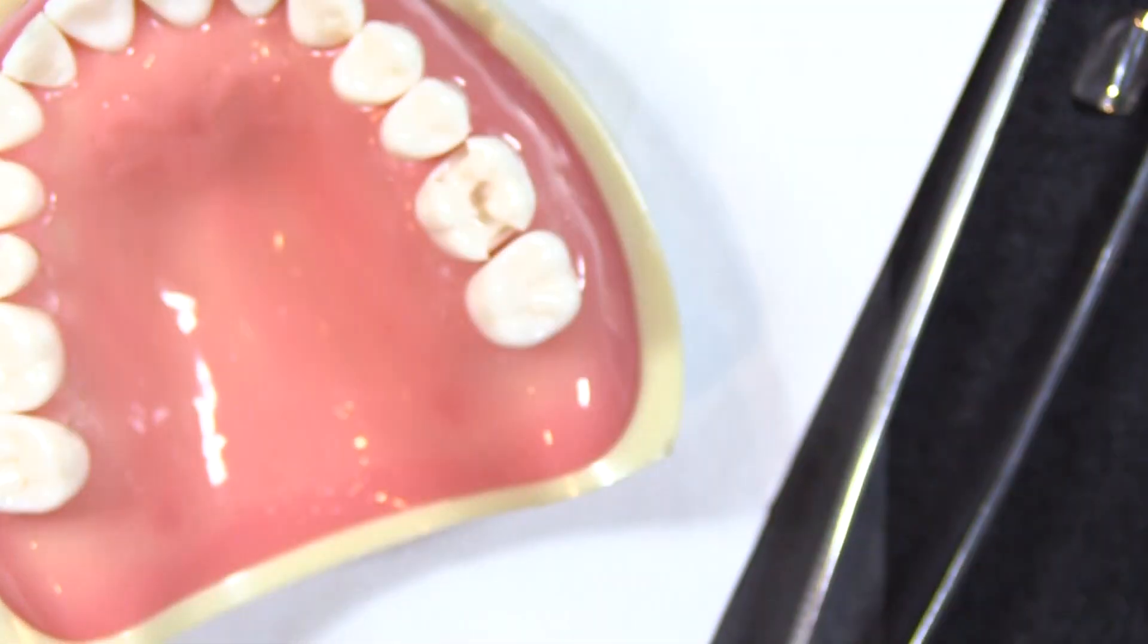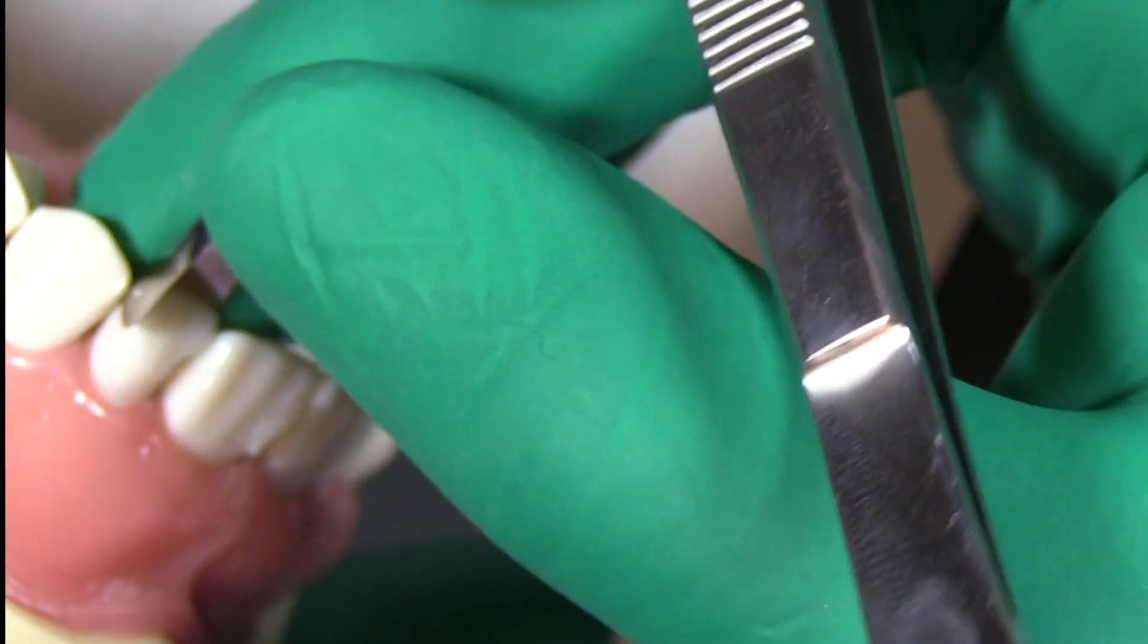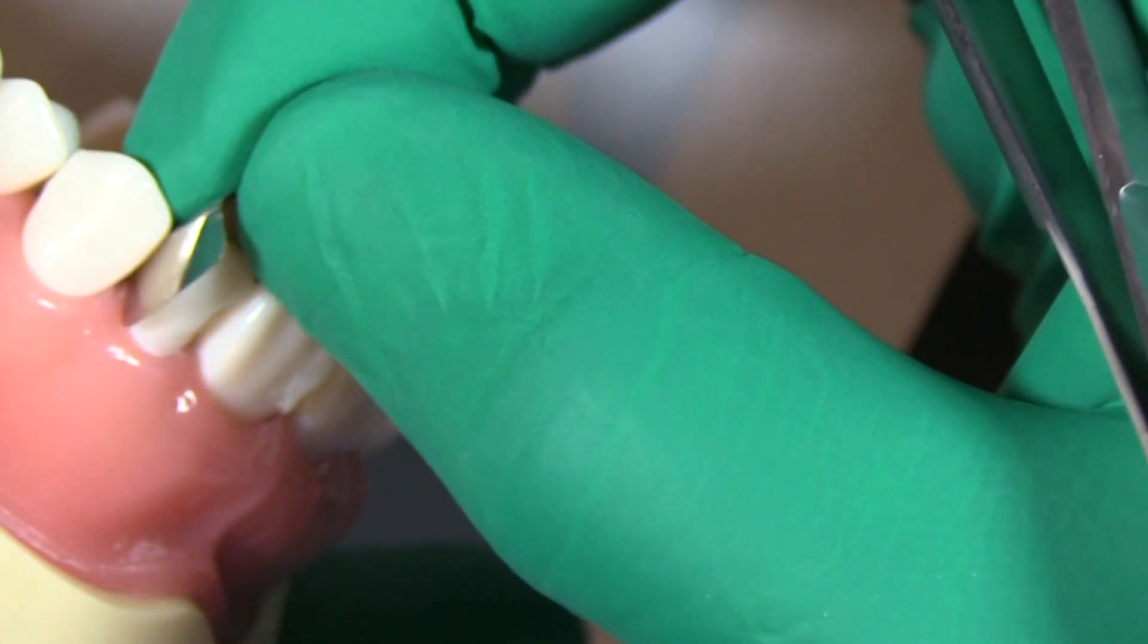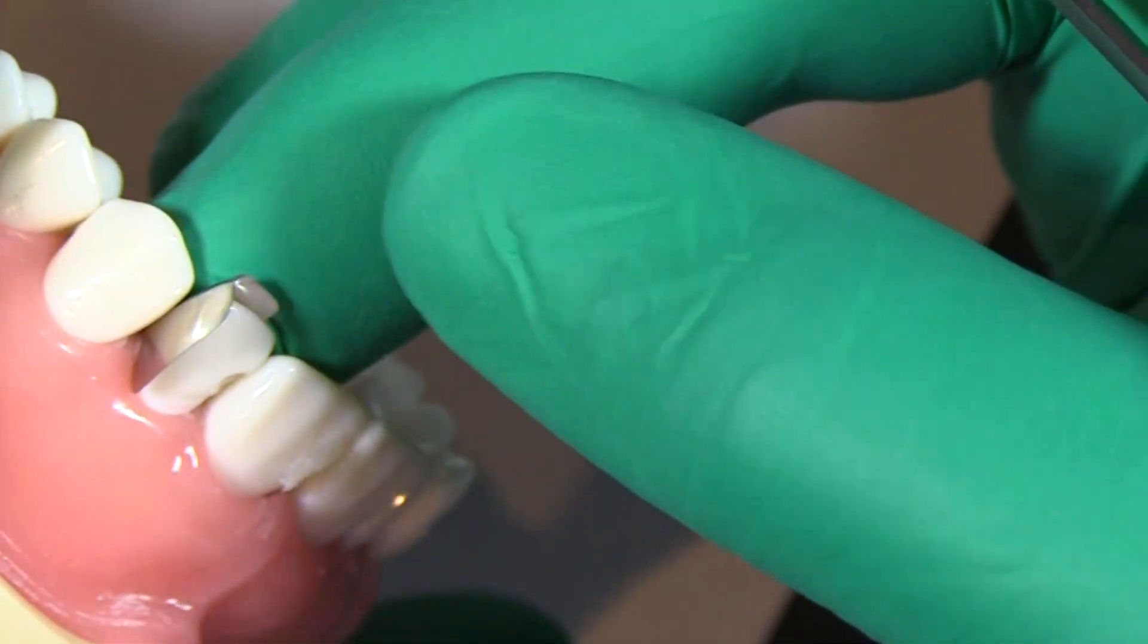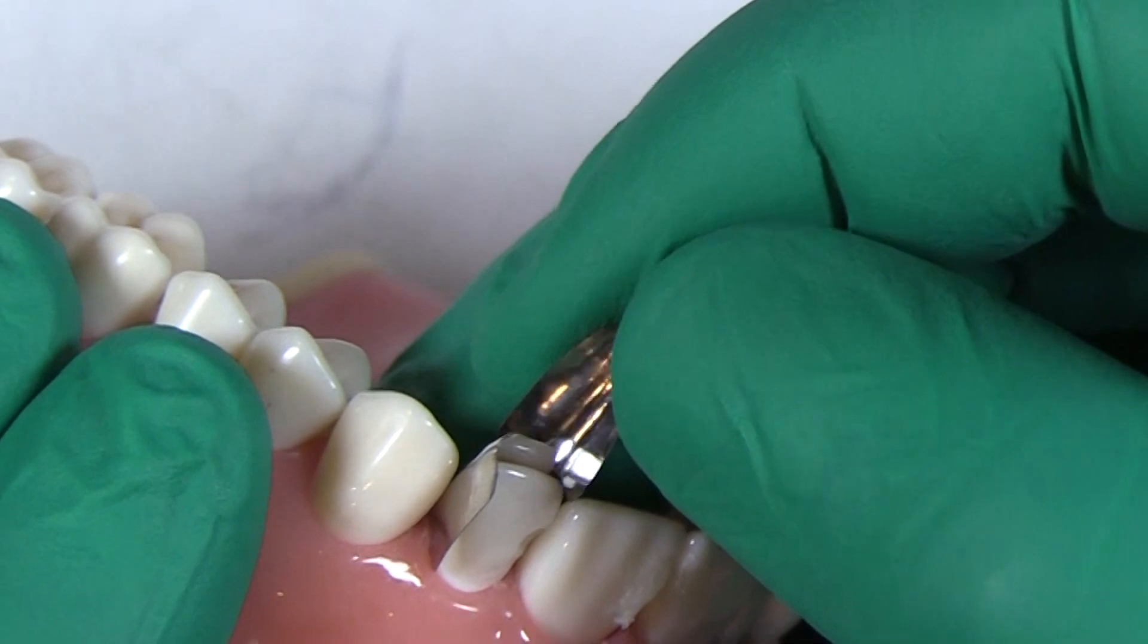And what we're going to do is we're going to grab two more of these fusion matrix bands. In this situation it's a smaller tooth, I could probably go with a smaller matrix band but you don't necessarily need to, and I'm going to put two in at the same time.